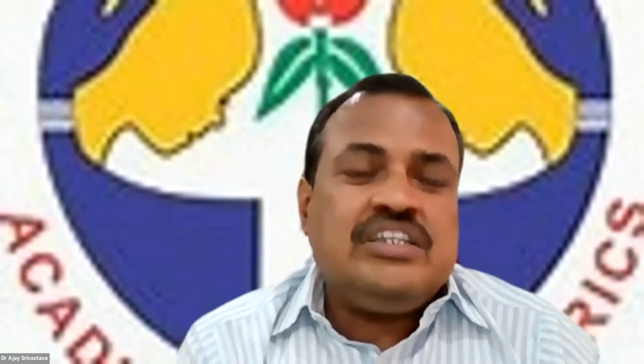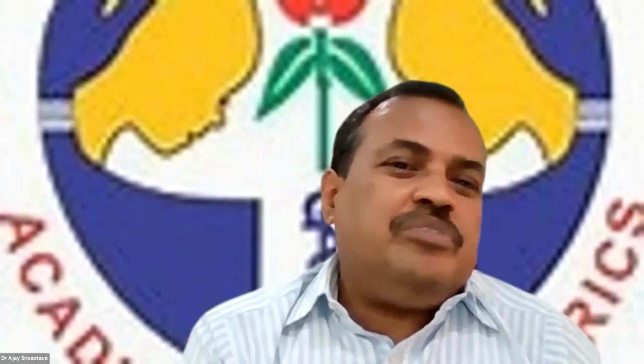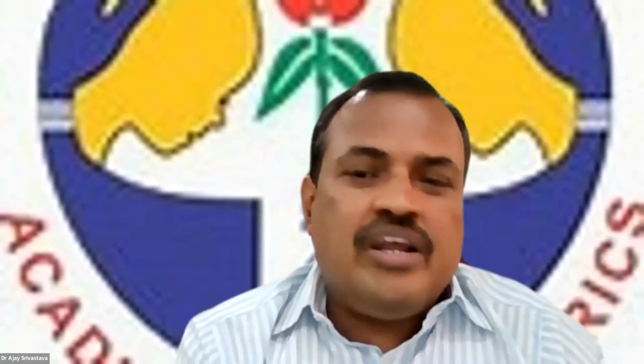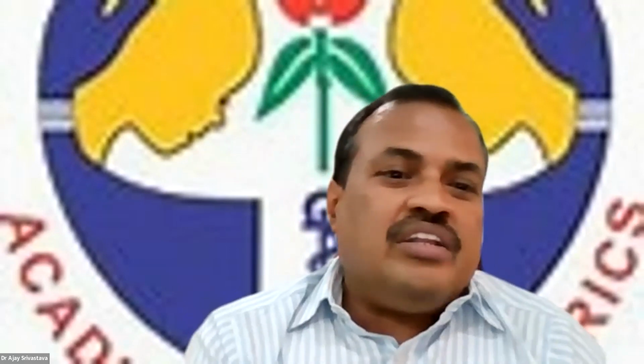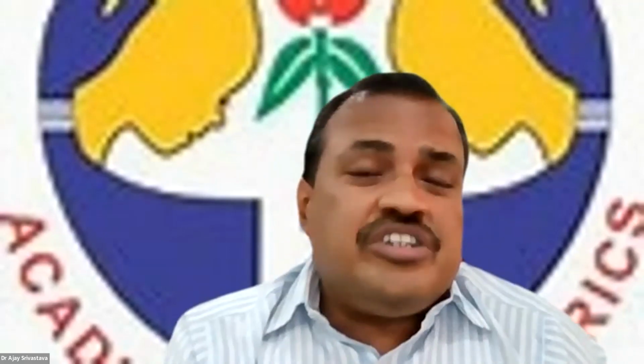One take home message is, first, unprovoked afebrile seizure, the best investigation is EEG, because it helps in syndrome identification and prediction of recurrence. And the risk of recurrence is increased by interictal spike discharge, especially focal spikes. So first, unprovoked afebrile seizure, you should always go for an EEG. And then these are the limitations of EEG.